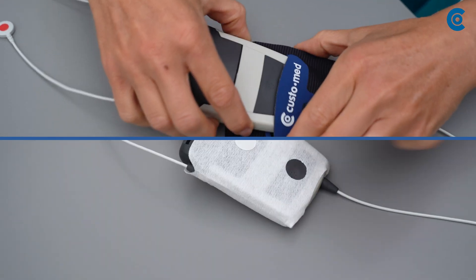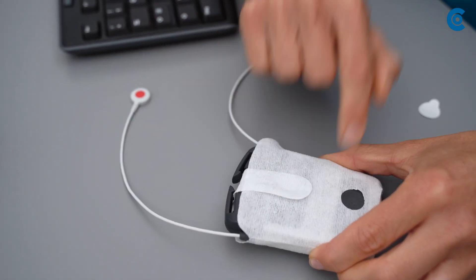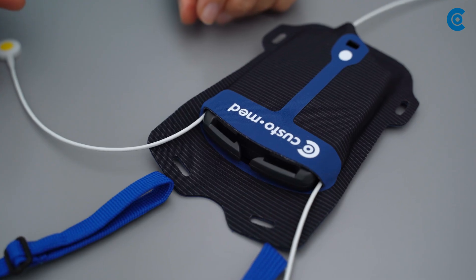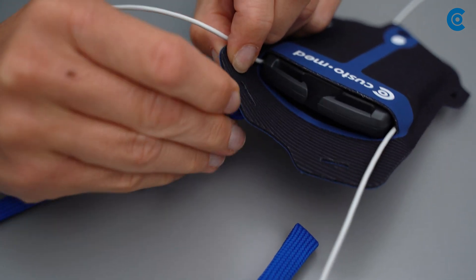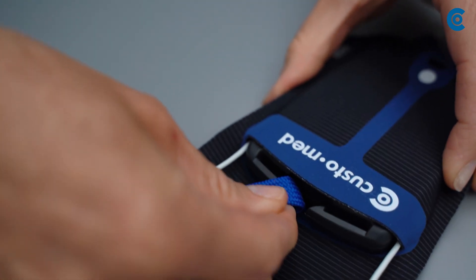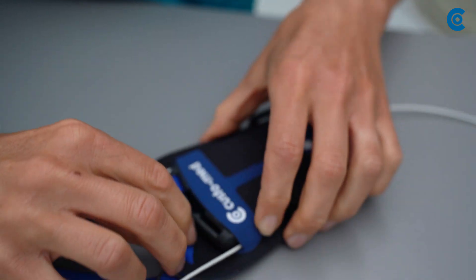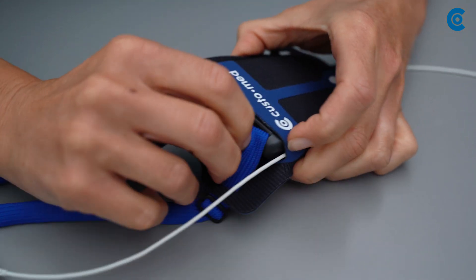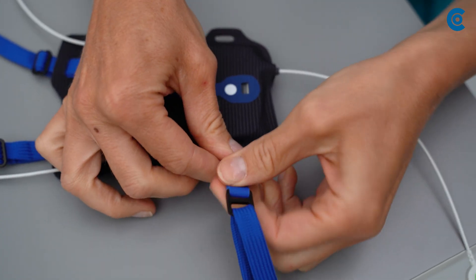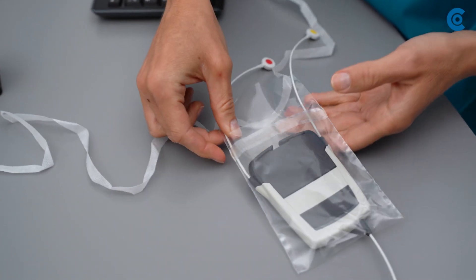If required, put the Custo Flash into a Custo Flash Protect and in a CustoMed carrying case. Guide the loops of the neck strap through the holes of the carrying case, place them around the strap holders of the battery and pull them tight. Attach the chest belt as well. Optionally, you can also use a Custo Clean Hygiene Bag FL.